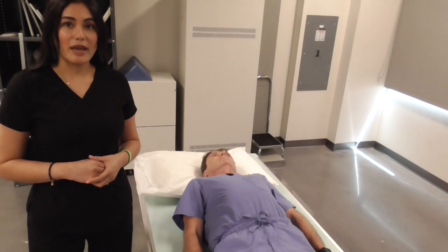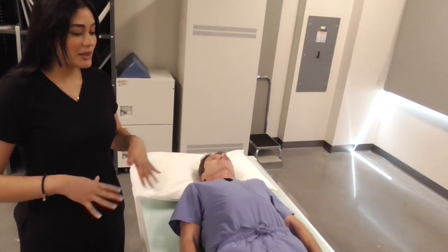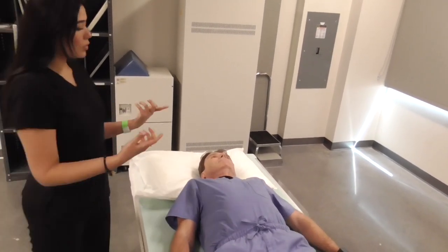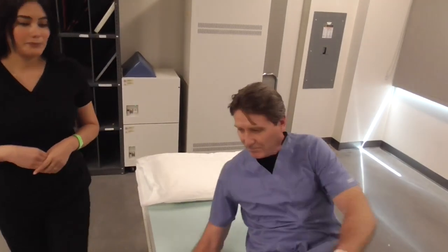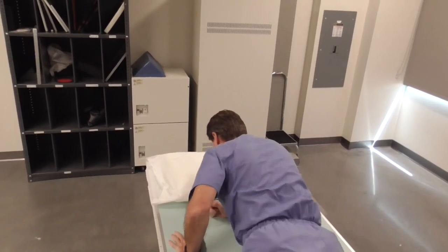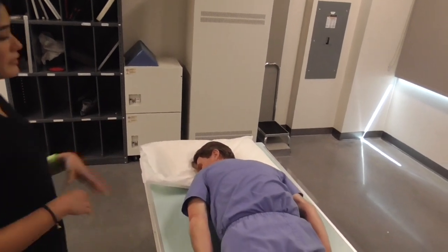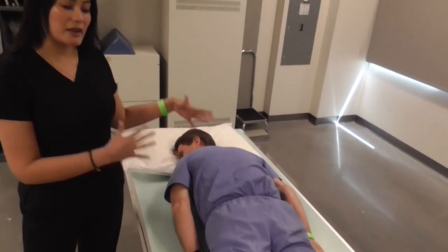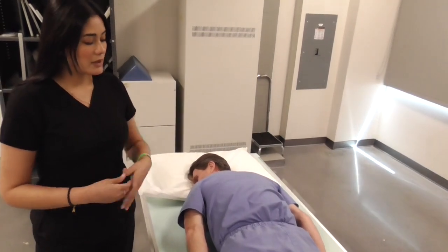So now we're going to do a prone position. I'm going to have him lay on his stomach — go ahead and roll over onto your stomach. And this is the prone position: face down, stomach down.